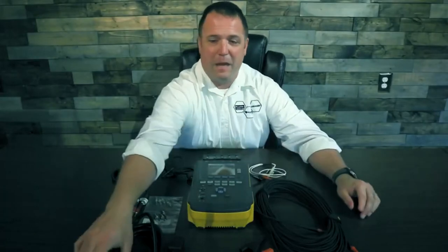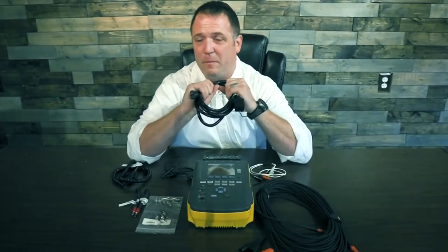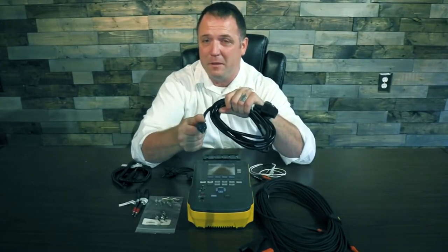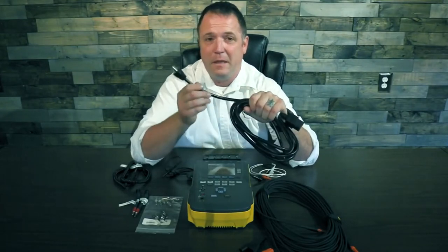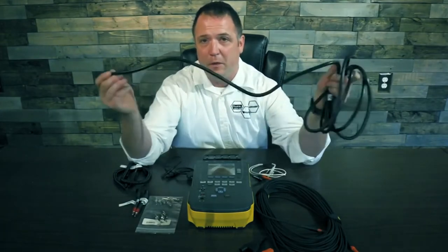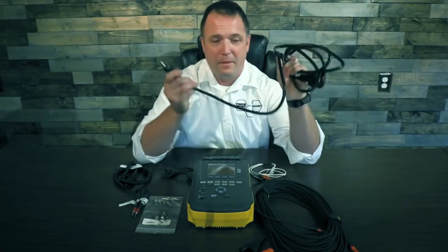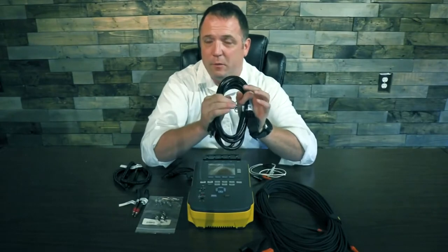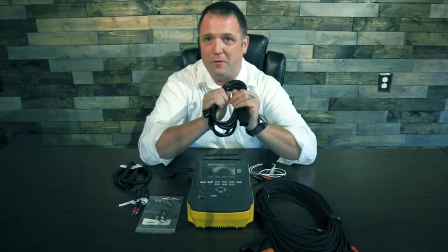The first accessory I want to cover is the power cord. If you've purchased any of our older devices, you'll notice the power cord on this one is slightly different. It only has a 15-amp plug, where before we had a 20-amp plug and you had to have an adapter. The cord used to be a little bit shorter — now the cable is about two feet longer, much more flexible, and comes with a 15-amp plug so you don't need that adapter. Reach out to your local Fluke rep or jump on our website for the part number.